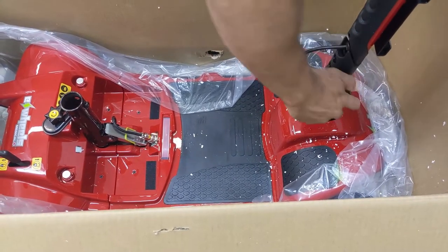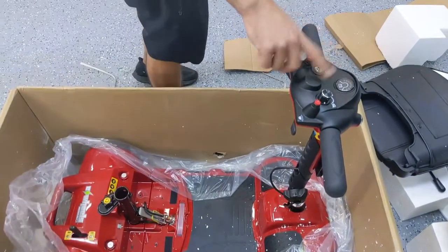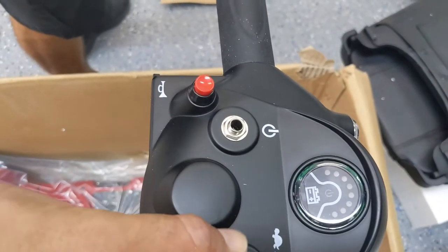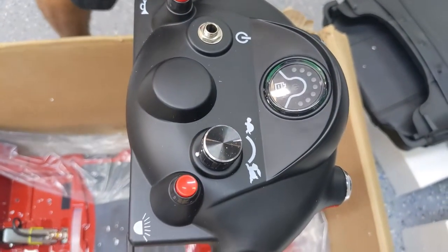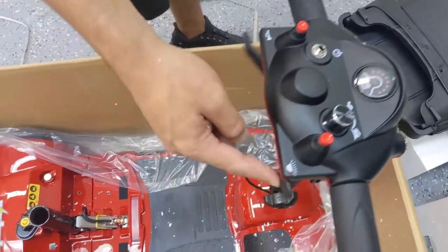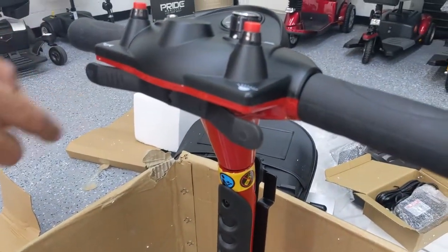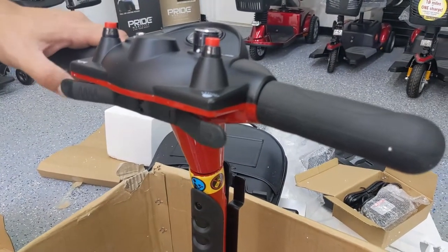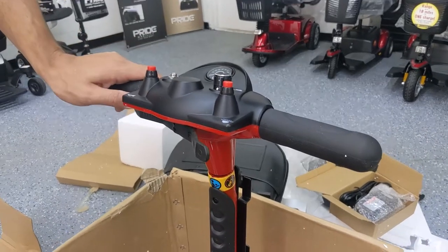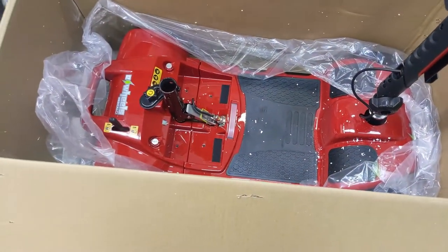This entire front section is called the tiller, and here are the handlebars. On the display on the dash, we have a standard battery meter, a key ignition slot, and a speed adjustment knob. We also have two buttons — one for the horn and one for the lights — and then the standard seesaw-like throttle system to go forward and backwards. You can use either your left hand or your right hand to do both forward and reverse controls — it's made for ambidextrous use.